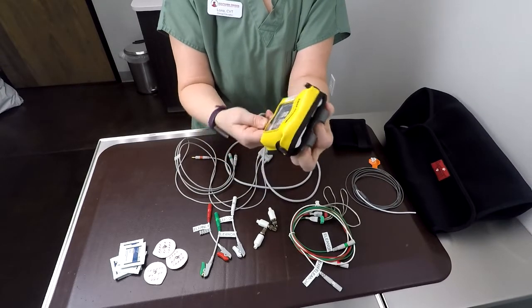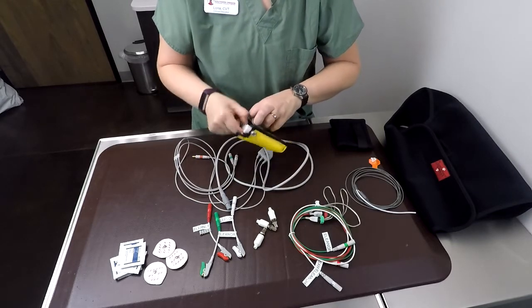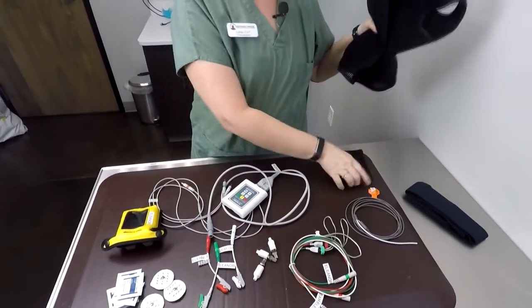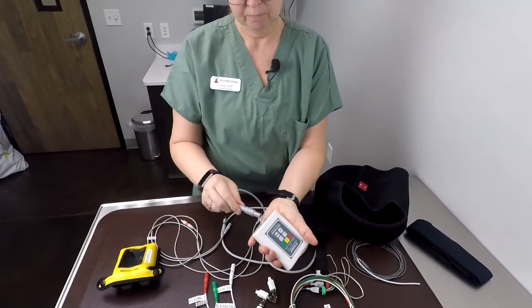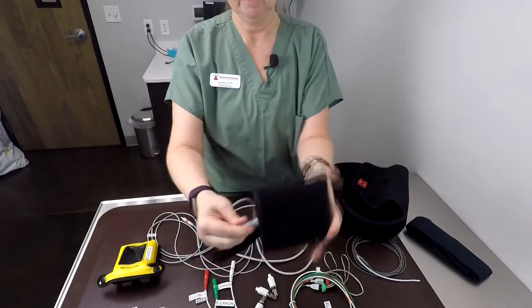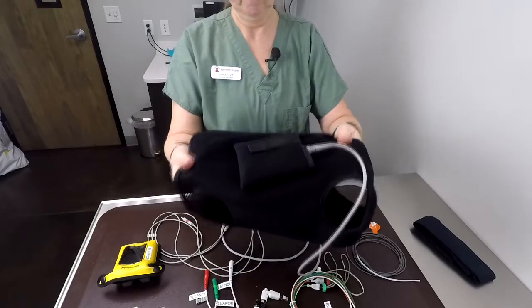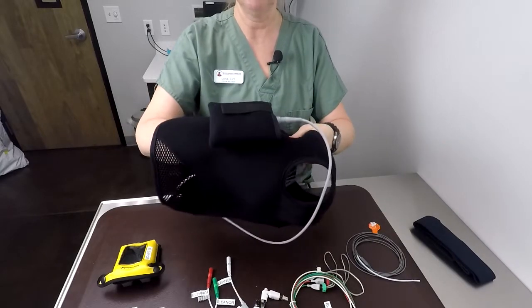The majority of our patients moving forward will be using our new cardio vests. We have these new vests ordered in four different sizes; this one is the medium. Each one comes with a velcro pouch — your unit connects and slides into the pouch, velcro goes over the top and secures, and then it attaches directly to the vest. The wires can be fed into the vest to be secured so they're not on the cage floor with your patient.